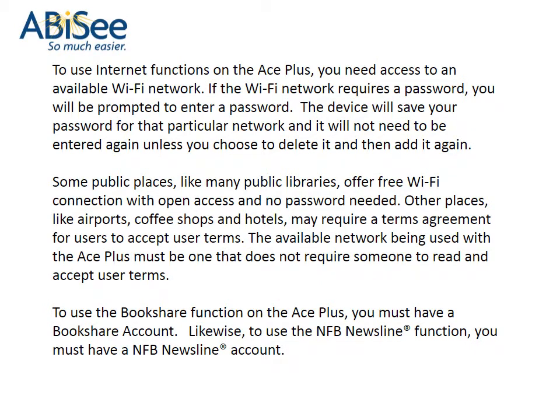To use internet functions on the ACE Plus, you need access to an available Wi-Fi network. If the Wi-Fi network requires a password, you will be prompted to enter a password. The device will save your password for that particular network, and it will not need to be entered again, unless you choose to delete it and then add it again.